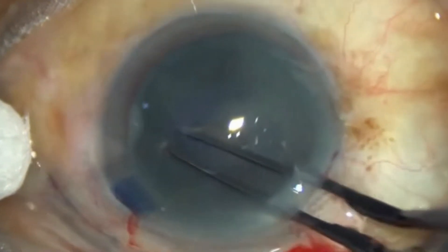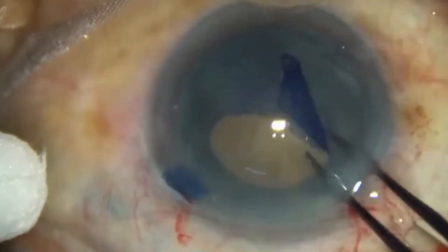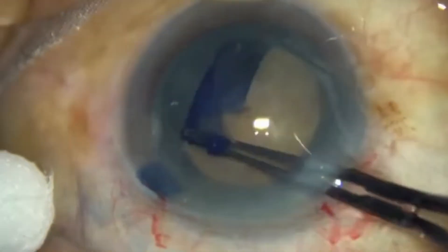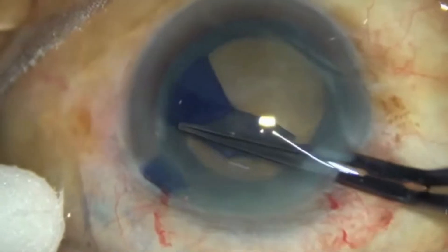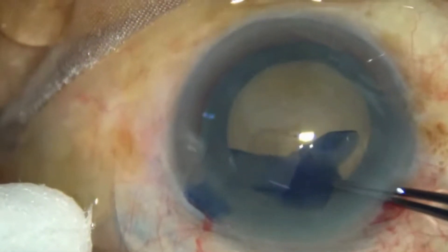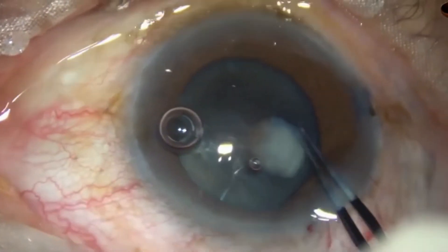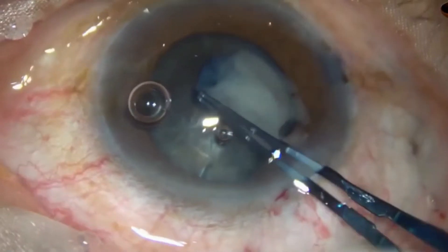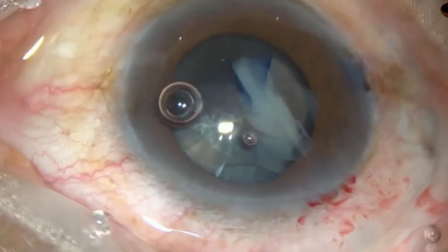Manually, the capsulorrhexis can be fashioned by creating a small tear in the center of the anterior capsule. The resulting capsular flap is then advanced into a circular shape by guiding the leading edge with a cystotome. Alternatively, the capsular flap can be pulled in a circular fashion by grasping the leading edge with forceps and advancing the tear with frequent regrasping.